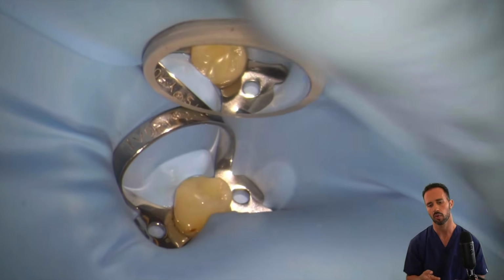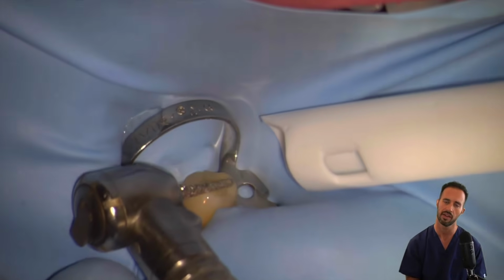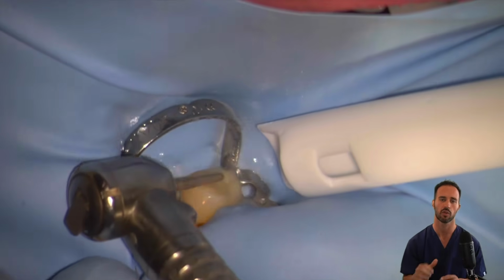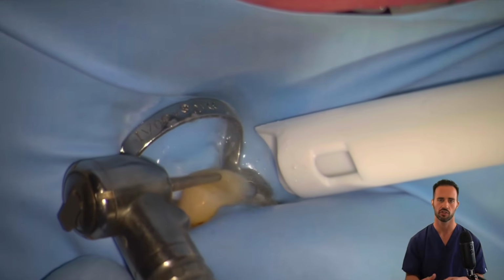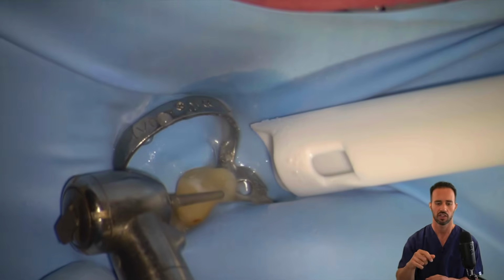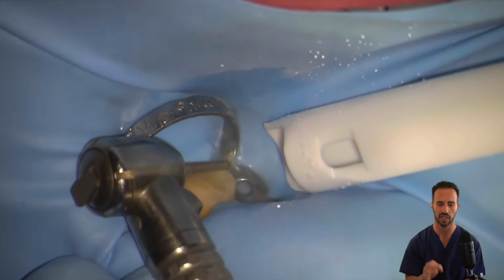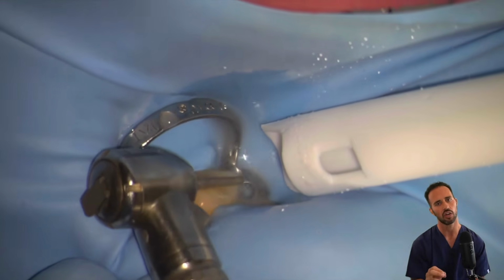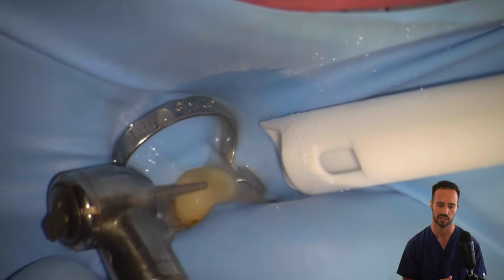Okay, that's really important for two main reasons. For number one, you want to have a really stable reference point for your instrumentation, because the rubber stopper on your rotary files needs to be ending at a very precise location every time, so that you know that you're actually instrumenting to the length that you think you're instrumenting to.